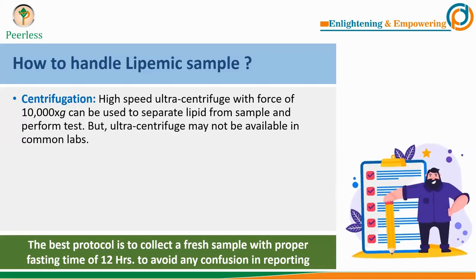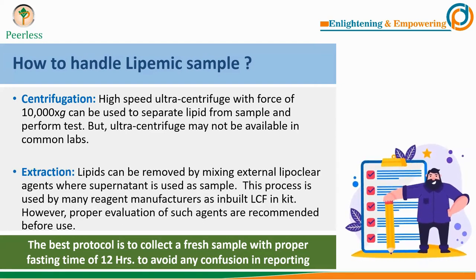Third, you can run the sample in a high-speed ultracentrifuge at a minimum of 10,000 g, which will separate the lipid part from the plasma. However, ultracentrifuges are generally not commonly available in routine laboratories. Fourth, lipids can be removed by mixing an external lipoclear agent, which clears the lipoproteins from the sample and the supernatant can then be used. Proper evaluation is recommended before using such agents for different assays. To reiterate, the best approach is always to repeat the sample collection after proper fasting and then re-perform the assay.